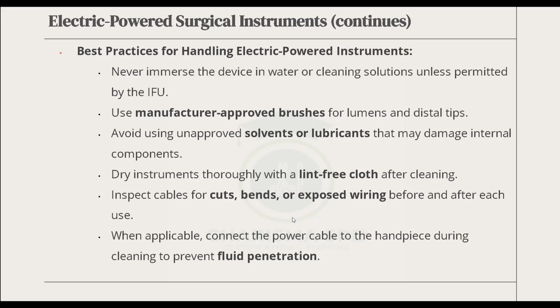Inspect cables for cuts, bends, or exposed wiring before and after each use. I mentioned that earlier. When applicable, connect the power cable to the handpiece during cleaning to avoid fluid penetration. When we come to the decontamination part, this point is very important. When you connect the power cable, you prevent water from going into the electrical connection part. Therefore, it's not going to get damaged whilst you are cleaning it. All right. Next slide, please.